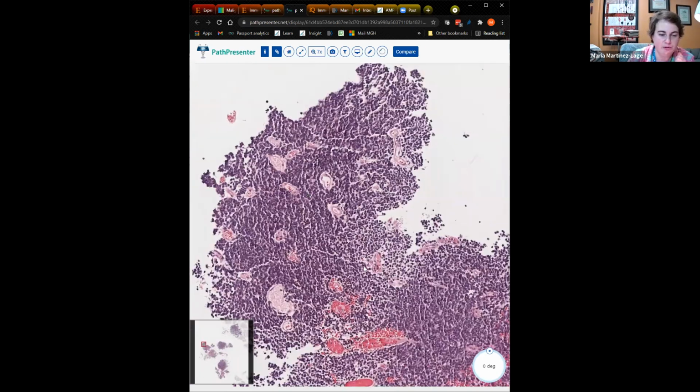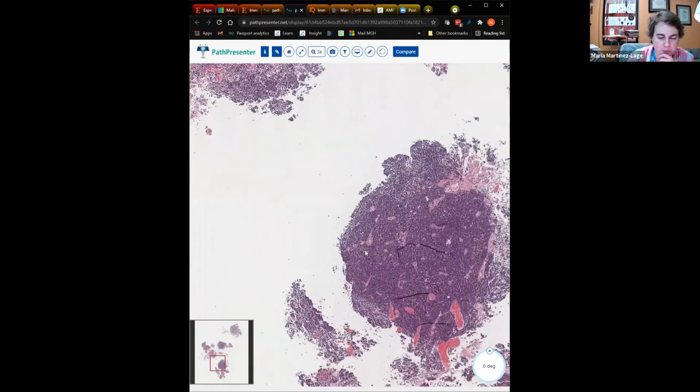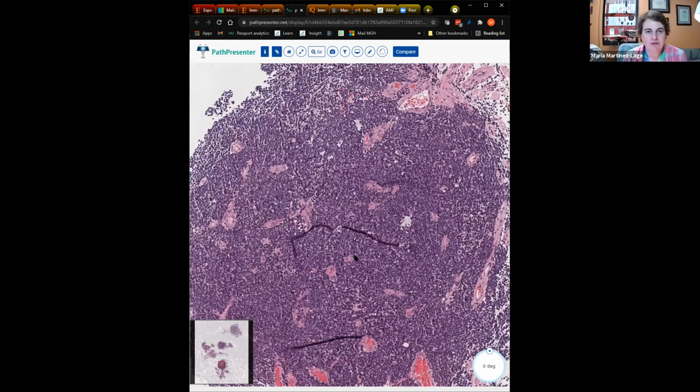And then, before we get to that, there's one very important thing to do before making the diagnosis of medulloblastoma, which is to rule out something called atypical teratoid rhabdoid tumor, which is a different type of embryonal tumor that can arise in the posterior fossa and that can mimic medulloblastoma. So atypical teratoid rhabdoid tumors can have this morphology, but they have a different prognosis. And so the way to rule that out is to do an INI1 stain. So if you demonstrate that there's loss of INI1 in a tumor that looks like a medulloblastoma, particularly in a child that is 2 years or younger, but not necessarily limited to that population, then that is an ATRT, and it has a different prognosis than a medulloblastoma.